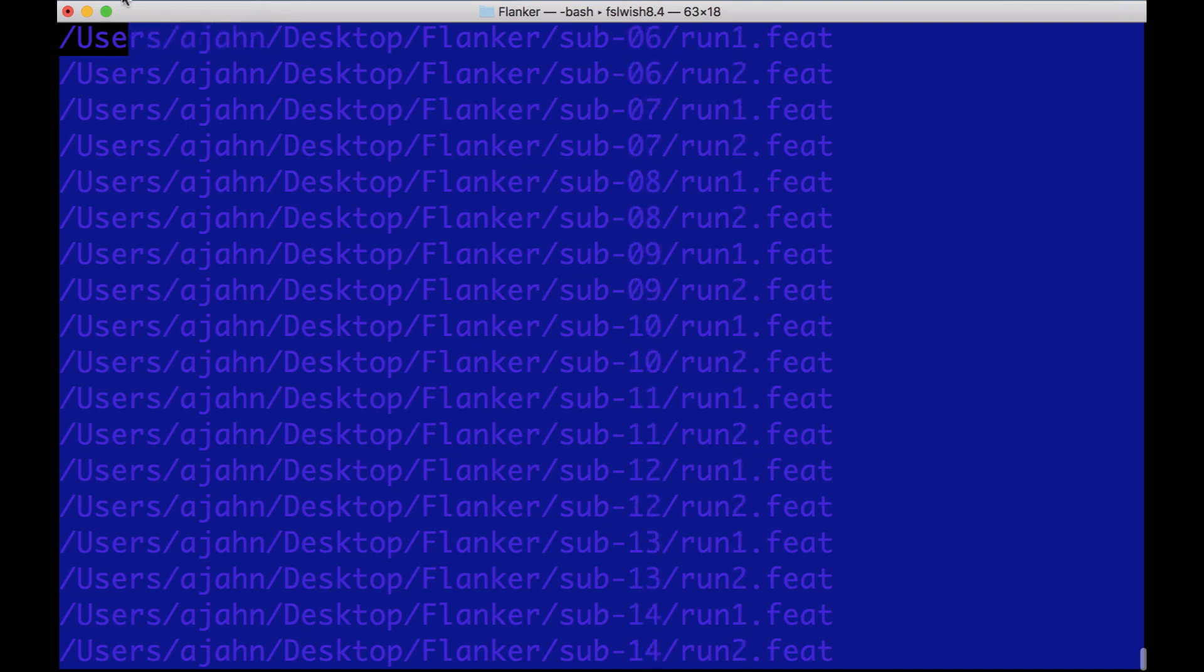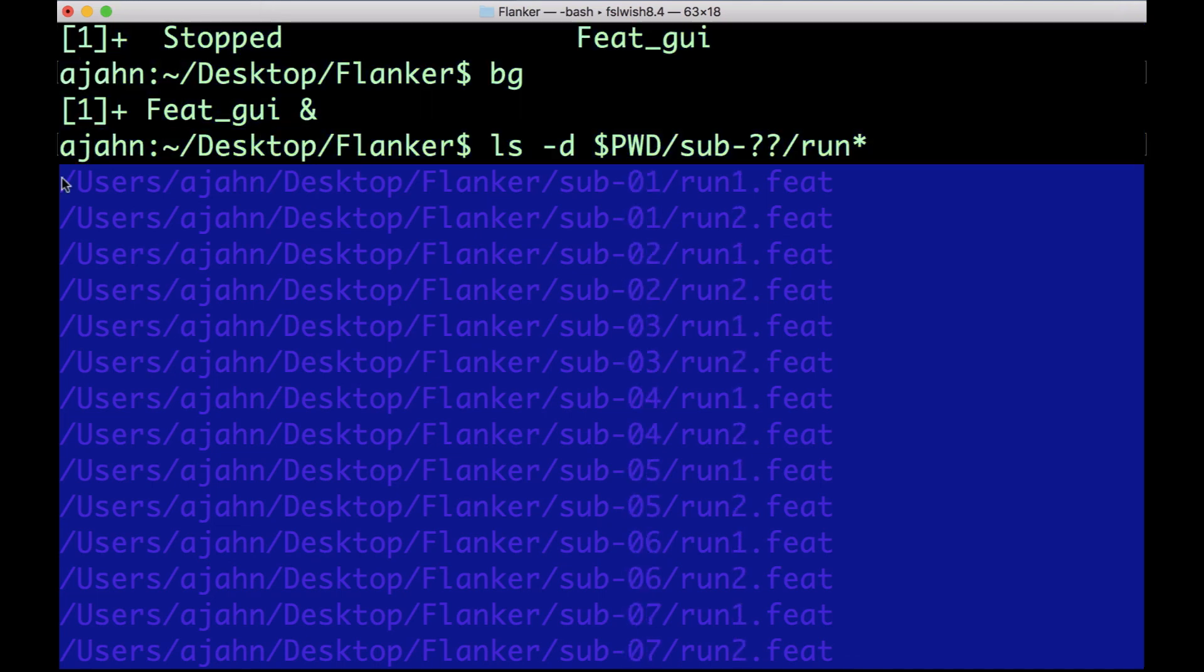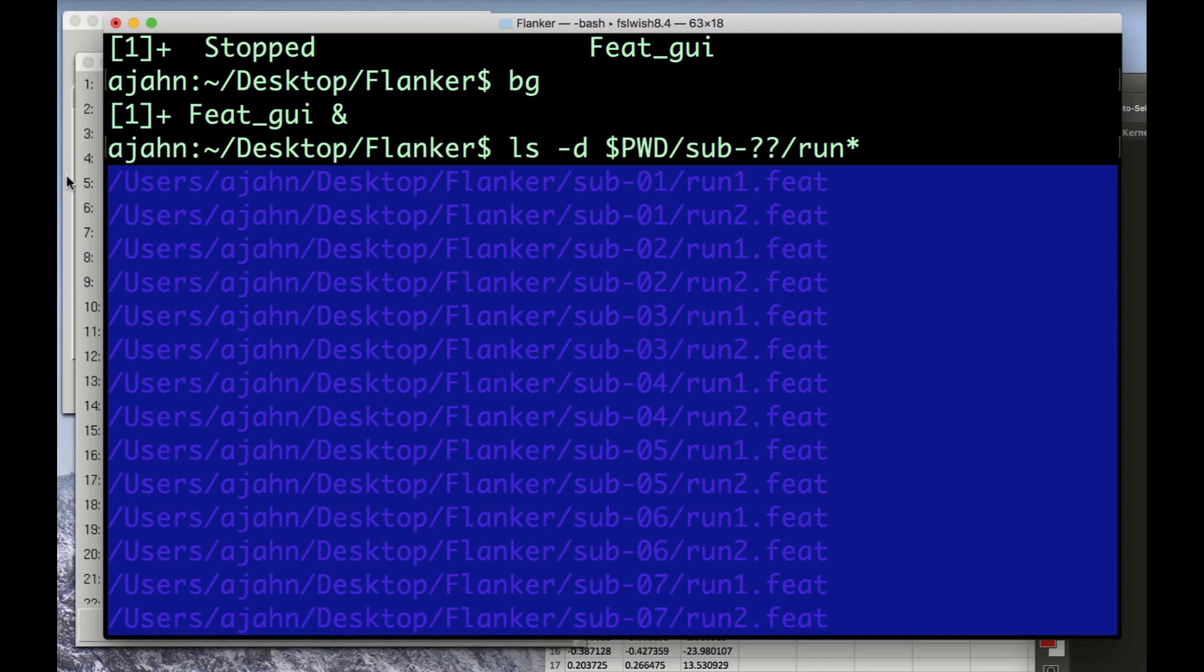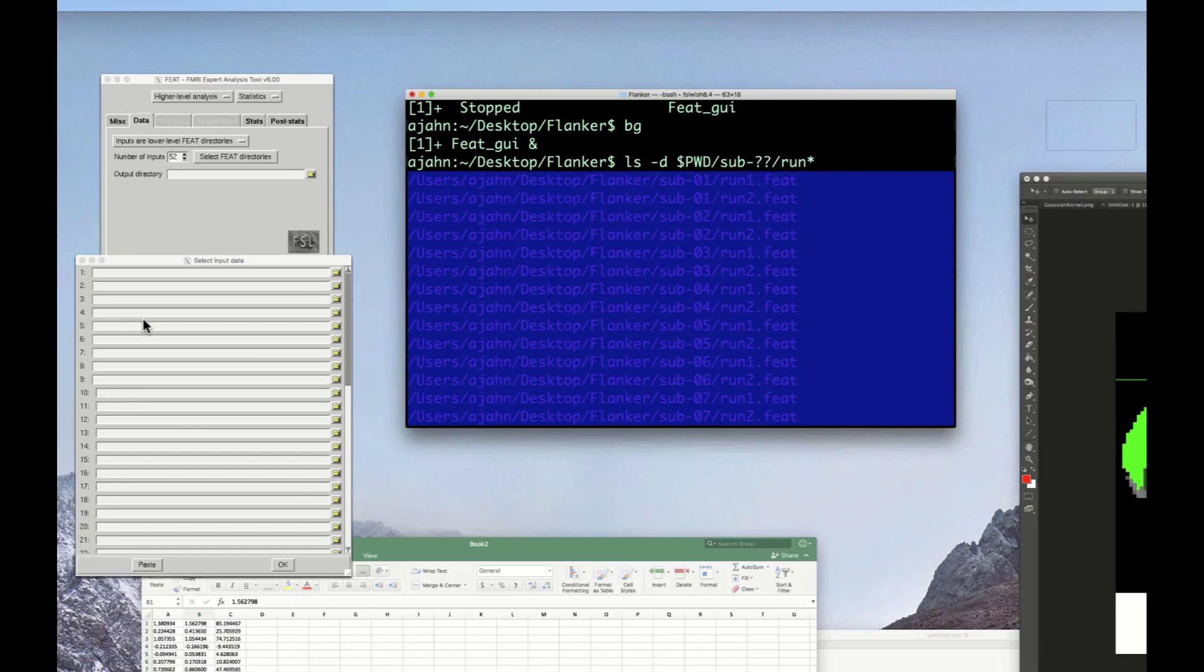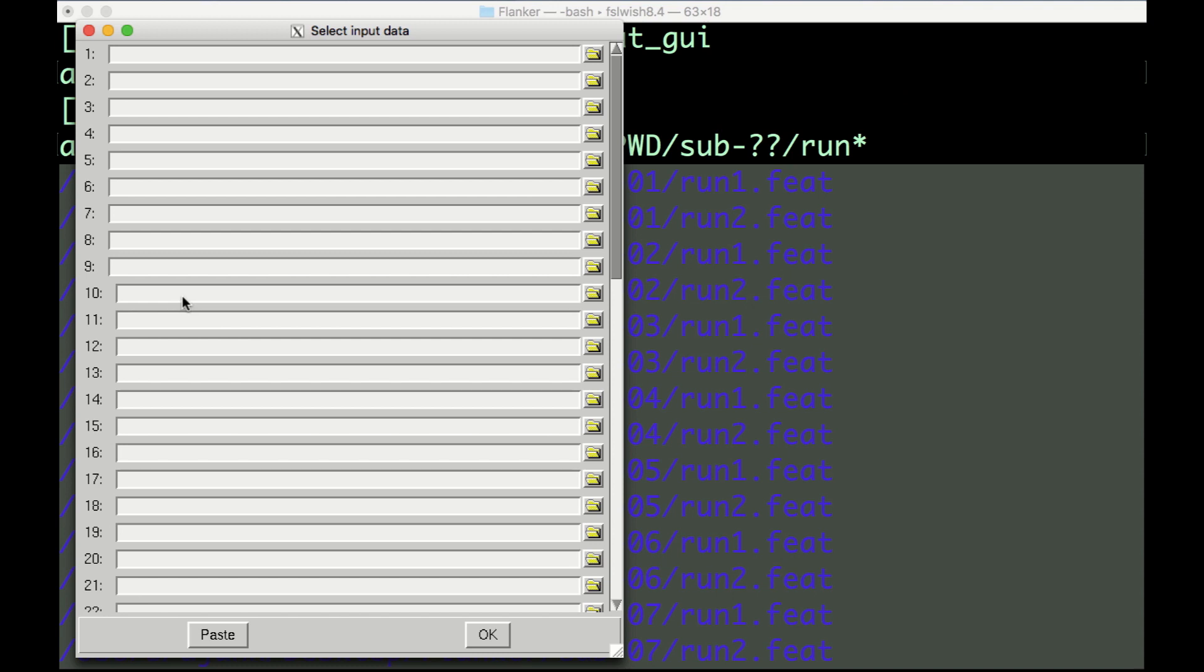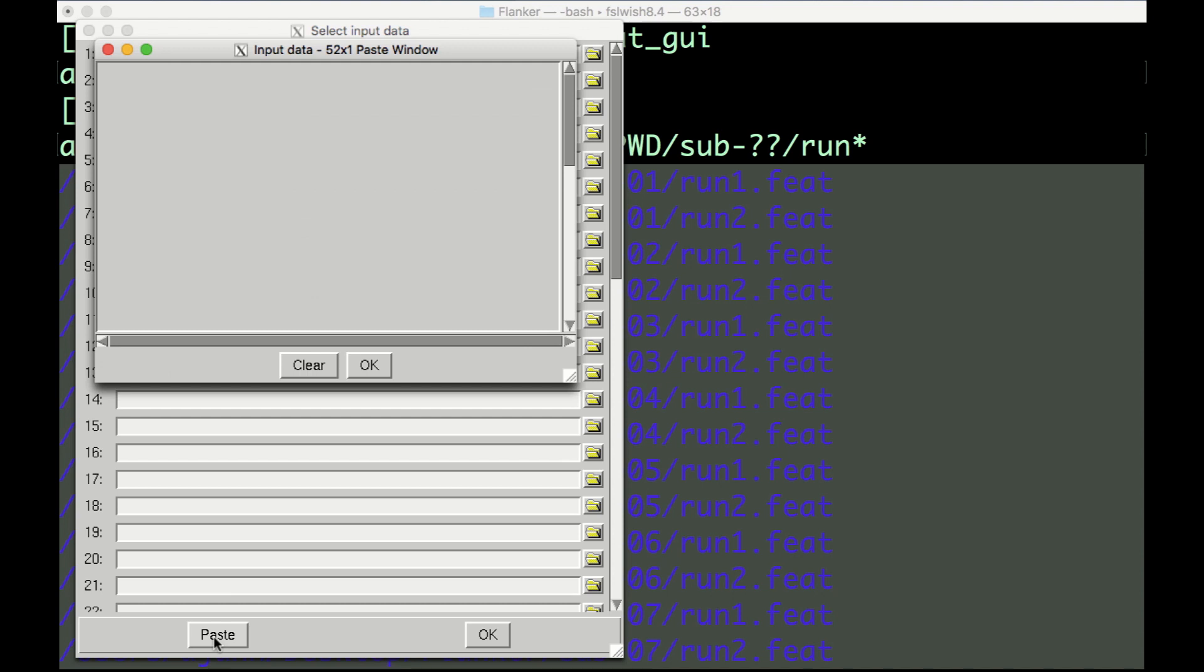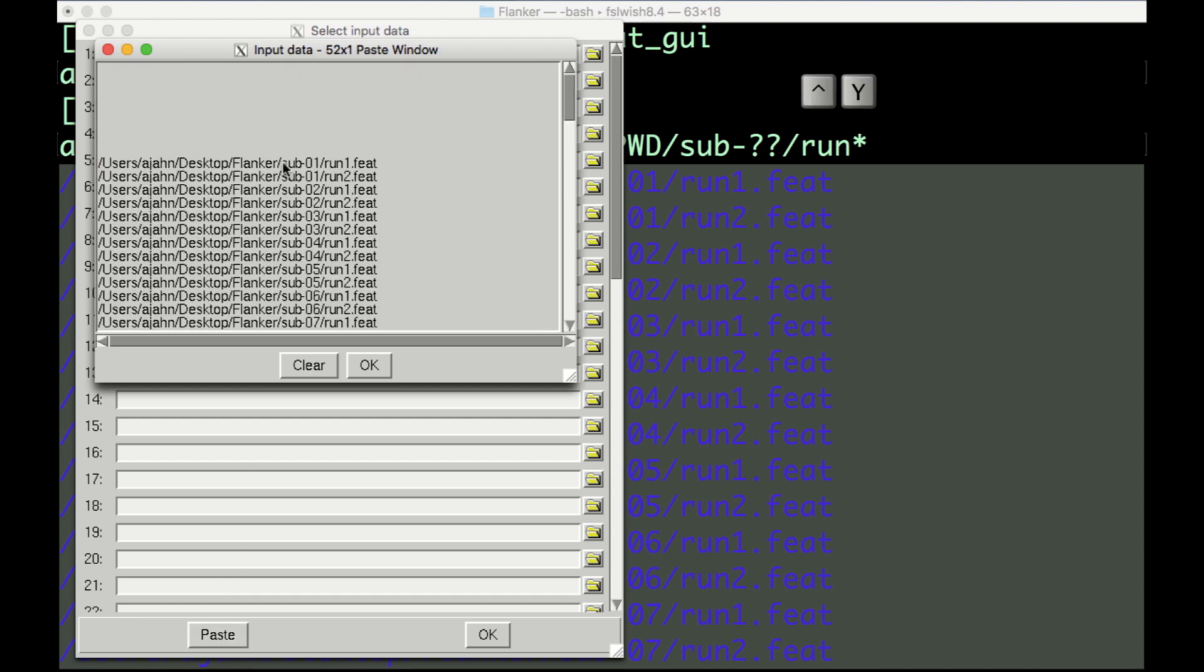Highlight the entire list, copy it, and then go back to the Select Input Data window and click on the Paste button. Then click inside the Input Data window, and press CTRL and Y to paste the directories. Then click OK.